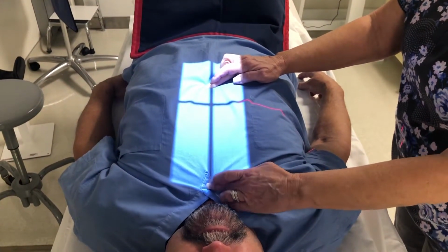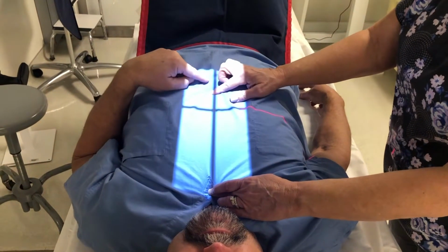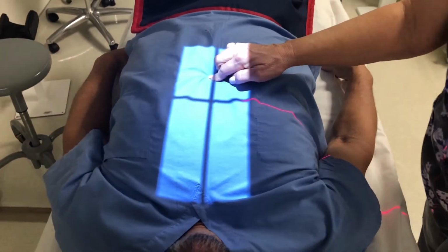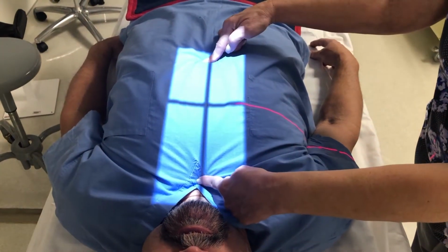You can palpate a patient's manubrium. You can ask them to point to the bottom of their sternum, and your central ray is entering halfway between those 2 points. So that's roughly T7, halfway between manubrial notch and xiphoid tip.